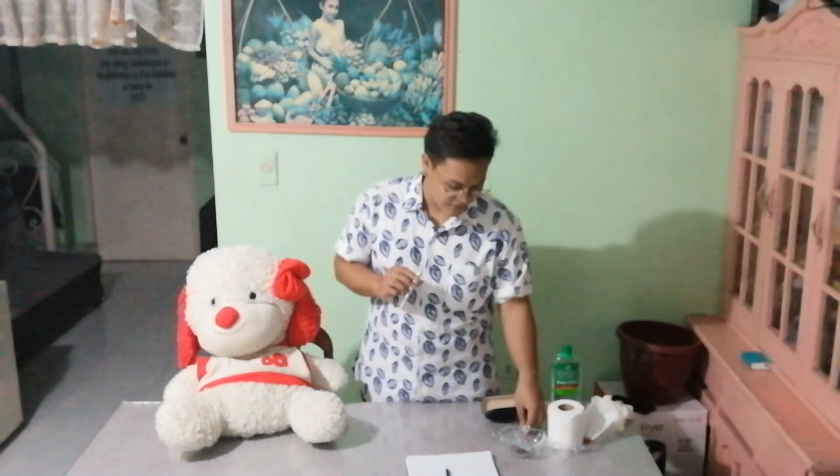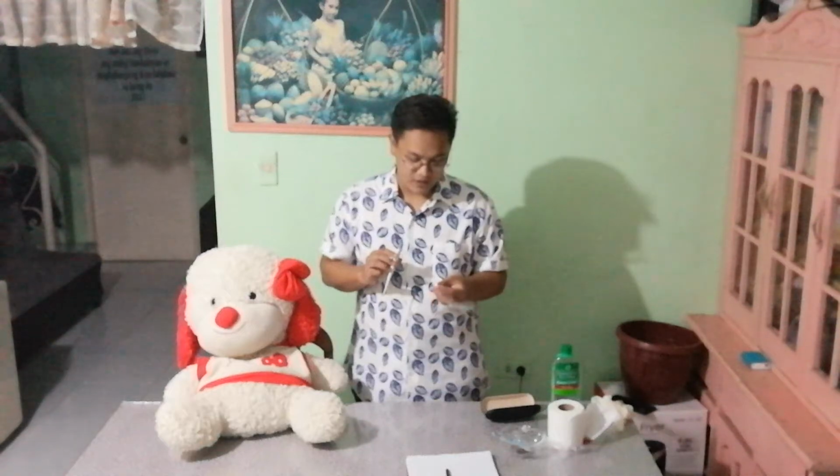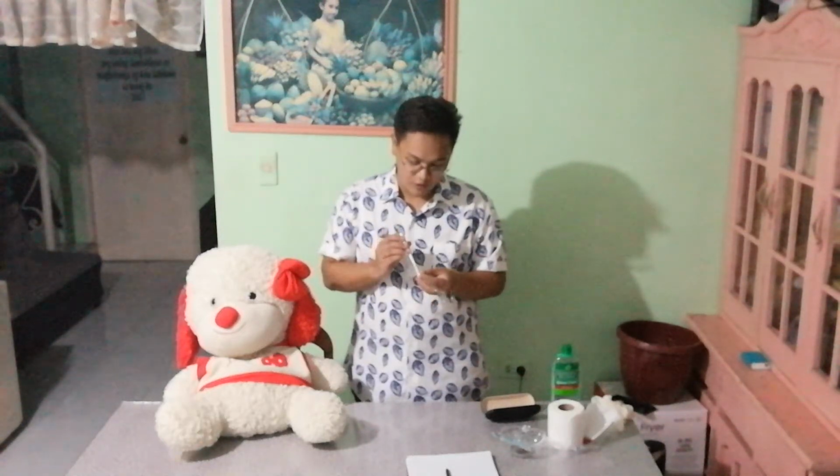We will need a disposable probe cover. We need to put the probe cover on the thermometer, slide it on and let it snap in place.